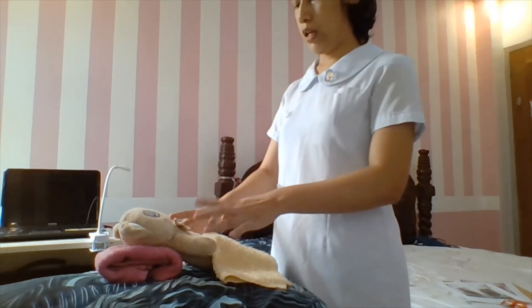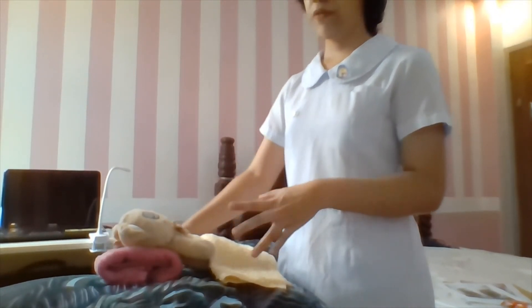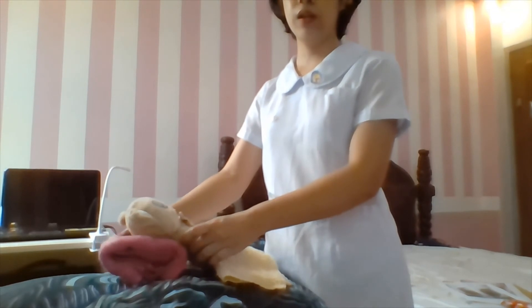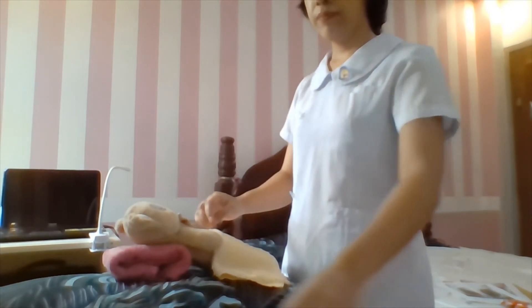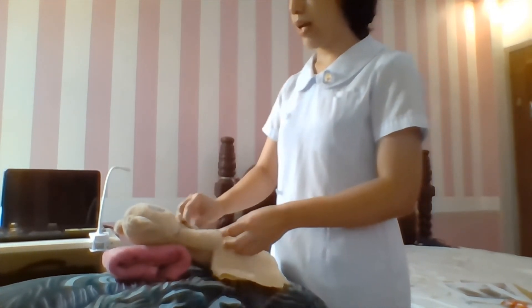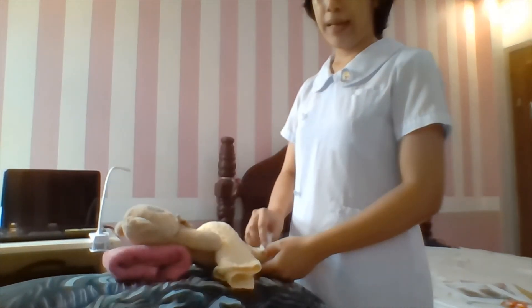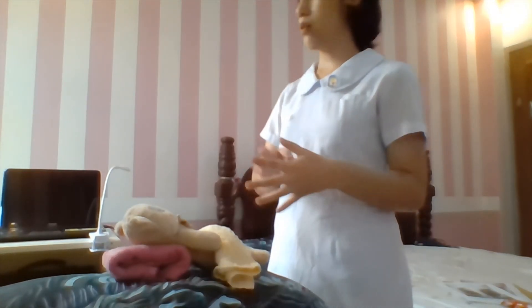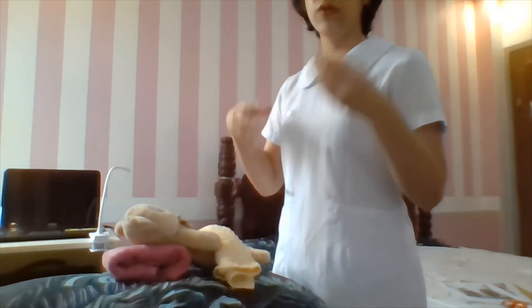Now that the procedure is complete, adjust the level of the bed to the previous position, lower the bed height, and adjust the patient's head and foot position according to his comfort. Cleanse the sites where you placed the electrodes and clean the ECG machine as per the agency protocol. Perform hand hygiene and remove additional PPE.